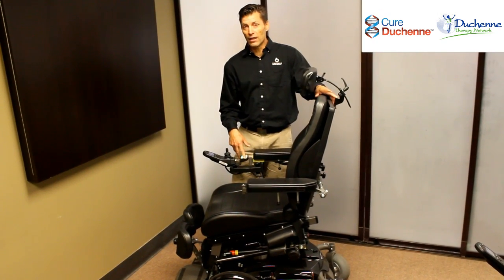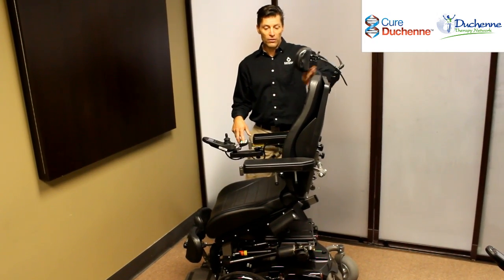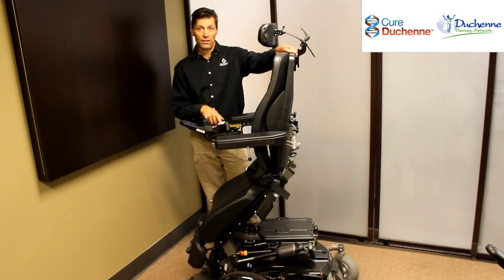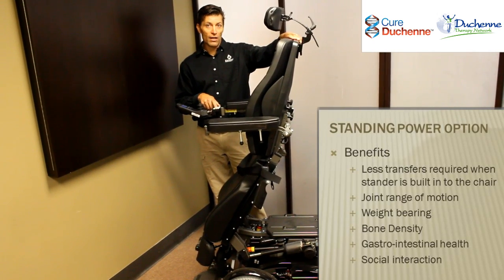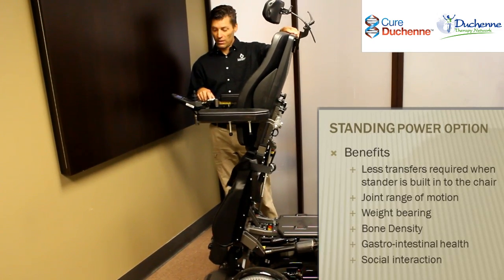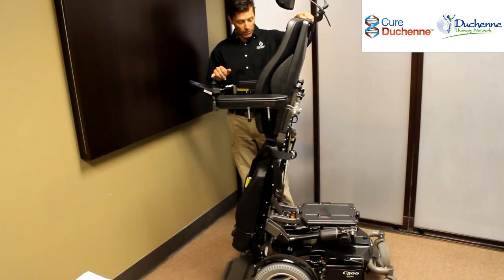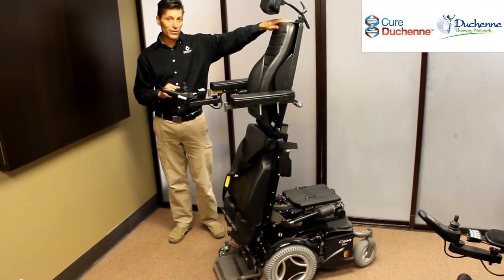The seat, if you look down at the end of the seat system, has knee blocks that support the person's lower body, and the upper body can have a chest strap or a bar across the front to provide additional stability. This chair then can go into a full standing position while it maintains your body supported, and it is so useful and beneficial to maintain bone density, to maintain full range of motion in the hips and the knee joints, and just to be able to interact with people and do functions that require to be at a higher level or standing. This particular model, once it's standing, will still drive at a reduced speed to allow you to move around and do things while you're standing.